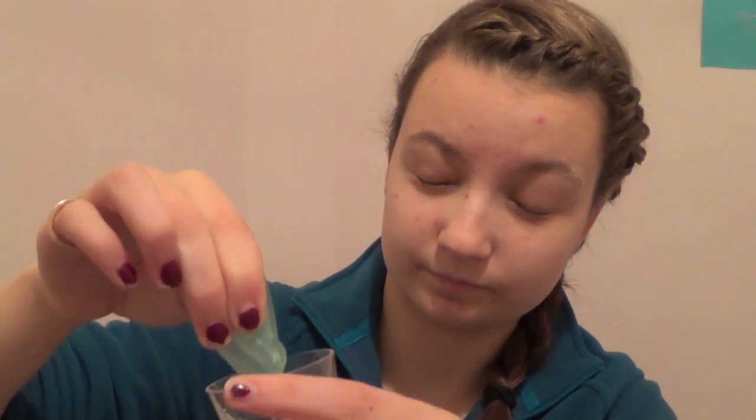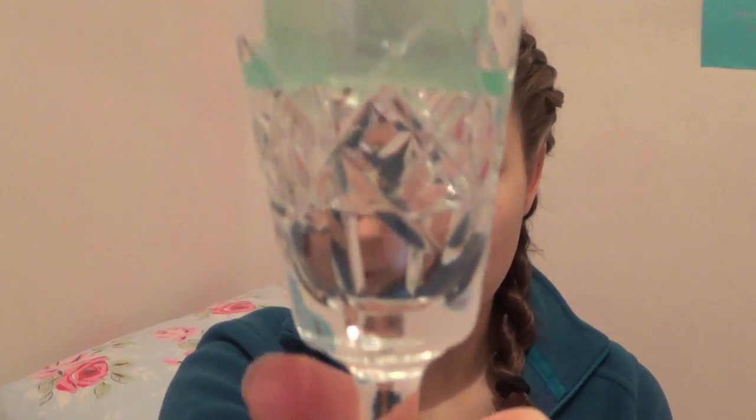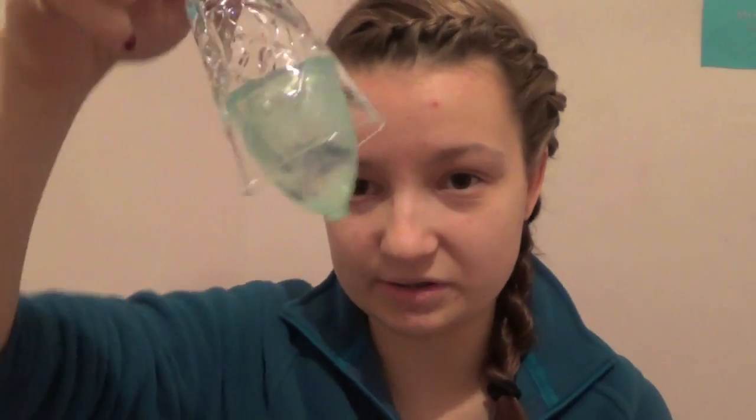We'll use the Lady cup for this. Now once your cup is open, so we'll use the punch down fold, open that up. So there you can see, it's not actually exactly straight, it's a little bit of an angle, but it should still hold the water. And once it's open, it won't leak. And you can see it's holding quite a bit of water there. That's quite a large amount of menstrual fluid, but you can see this cup still isn't at its full capacity.